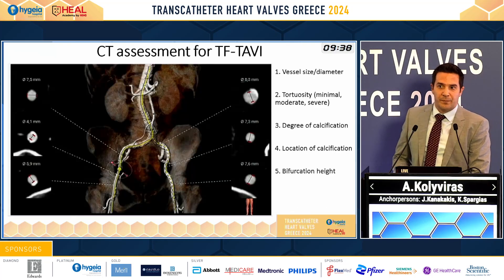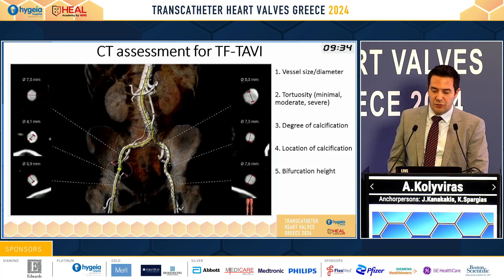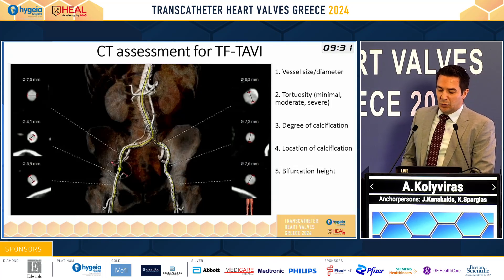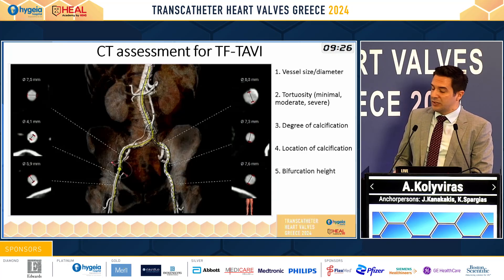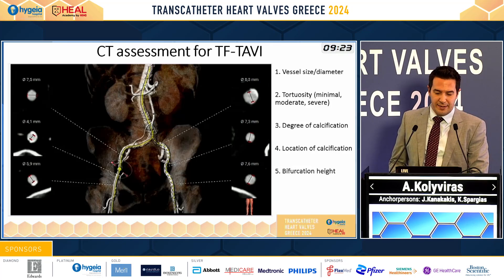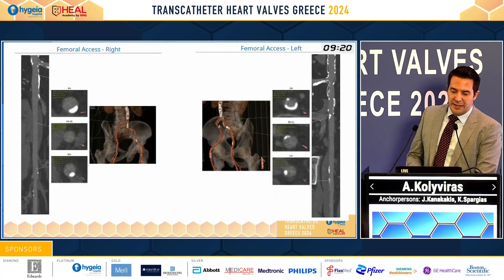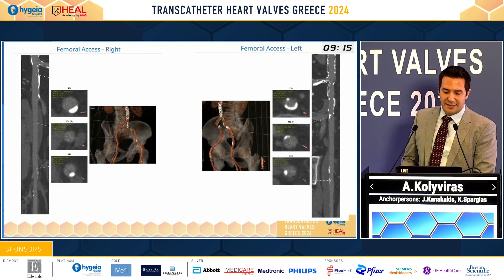CT assessment gives us all the important information regarding vessel size and diameter, tortuosity of the vessel, common femoral artery and the iliac arteries, the degree and the location of calcification, and the bifurcation height. We have to examine each vessel, the right and the left side separately, in order to decide for the best access.